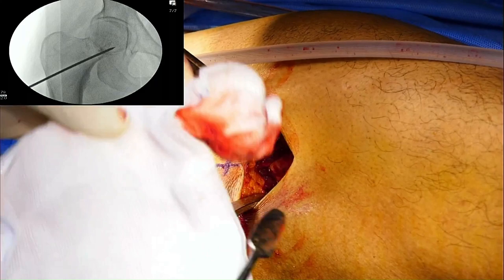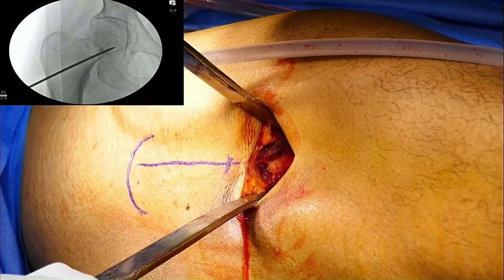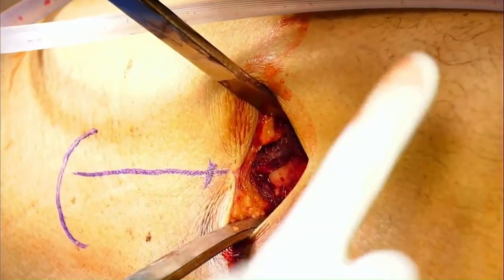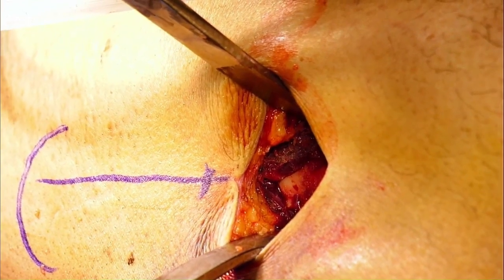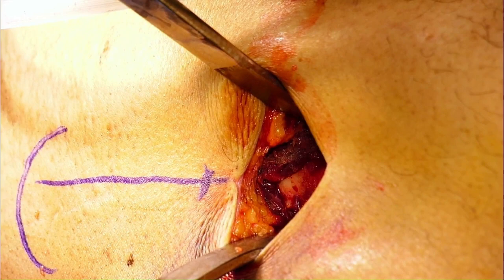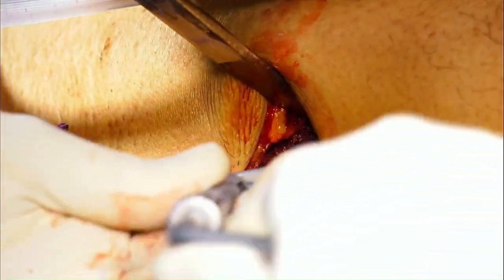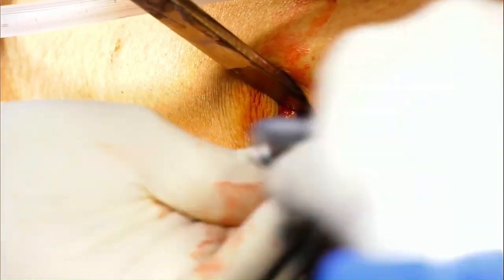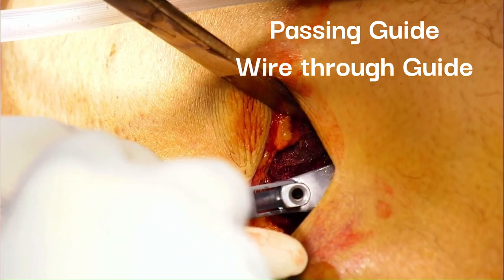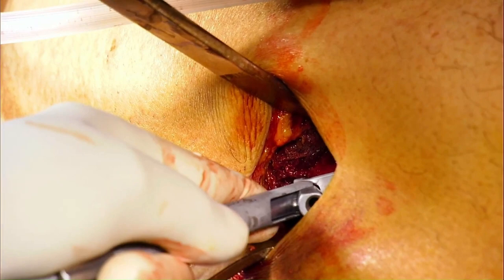Can you zoom in on this area? This is the foot end. Now, with the guide pin and jig — I take the jig — if the inferior part is kept over the bone, this makes an angle of 135 degrees. I pass the guide wire.